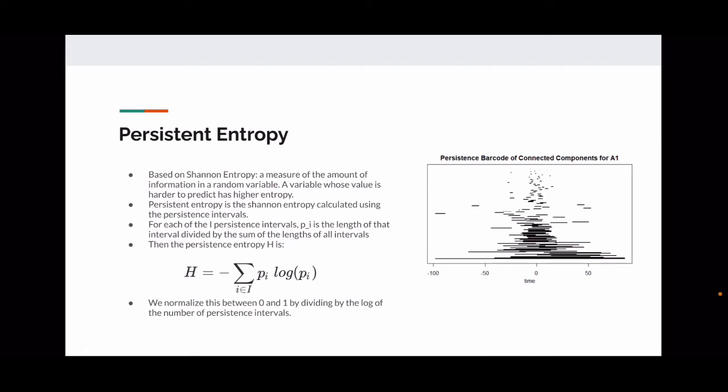And we do that for each signal in the EEG and take the average to get the final number. Oh, okay. So with all the channels? Yeah. So the average of all the channels is what he used. Interesting. So would that be different to detect focal seizures in one specific spot compared to a generalized seizure where it's every single channel pretty much? Yeah, possibly. Maybe if you're just looking for focal seizures, you'd only want to consider specific channels, but then you don't know which. Yeah, you don't know where the focal seizure is coming from.